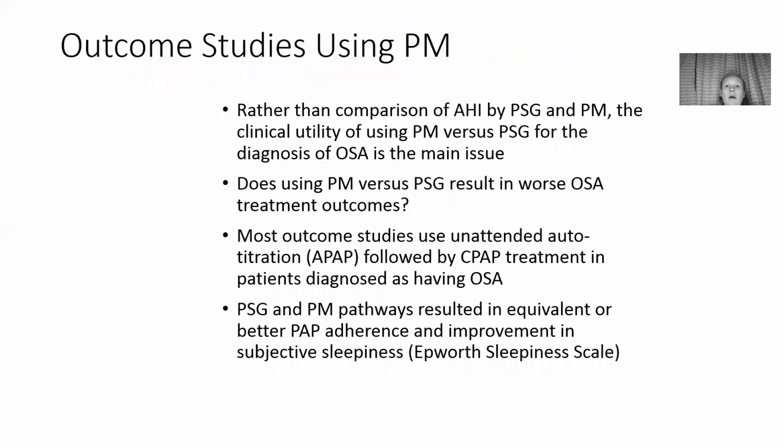Outcome studies using portable monitors. Rather than comparison of the AHI of a standard sleep study and a portable monitoring, the clinical utility of using portable monitoring versus in-lab sleep studying for the diagnosis of OSA is the main issue. Does home sleep testing versus in-lab sleep testing result in worse OSA treatment outcomes?